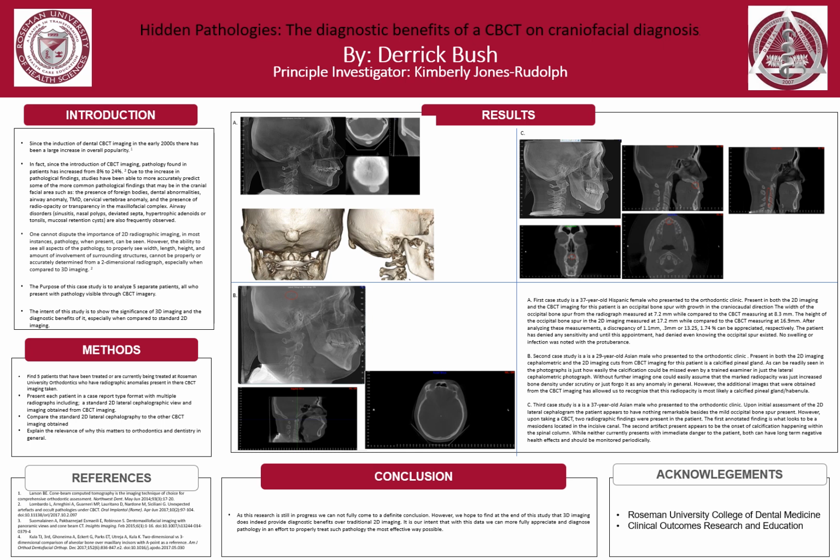When we move on to our case B, which is our second patient, the bottom patient under the results section, this was a 29-year-old Asian male who again presented to the orthodontic clinic. Present in both the lateral ceph and in a 2D image cut from a CBCT, you can see that this patient has a calcified pineal gland. The interesting thing about this though is that, if you were not using CBCT images to get the different sagittal and axial cuts and really analyzing, you might miss this finding due to how small and unremarkable it shows on the lateral ceph.